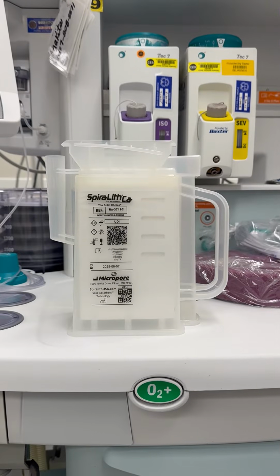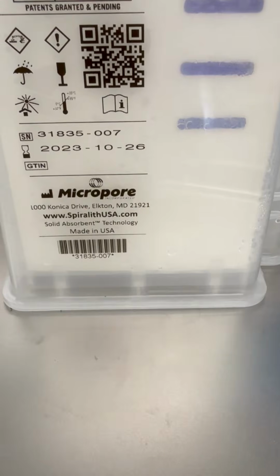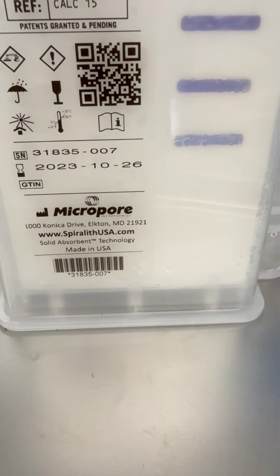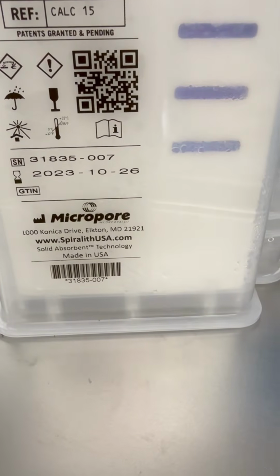After the canister is installed, the leak and compliance test should be performed. During use, SpiraLith Ca will produce the same amount of water as granular absorbents, but this water may be more visible because it is not hidden by granules.